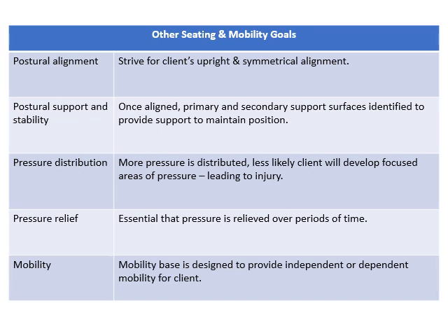And then, of course, another secondary goal is mobility. The base is designed to provide independent or dependent mobility for the client. So, of course, we want our clients to be independent, but there are clients that need to be pushed by somebody else, right? They don't have the ability for independent propulsion. So the base of the seat is going to be designed according to that need. And we'll learn more about that coming up.